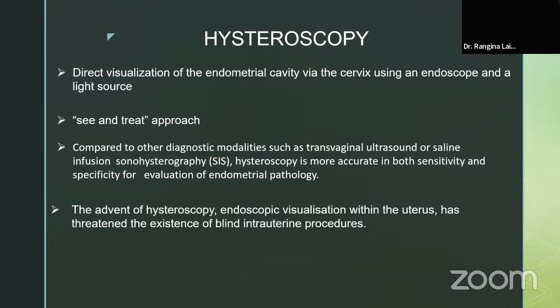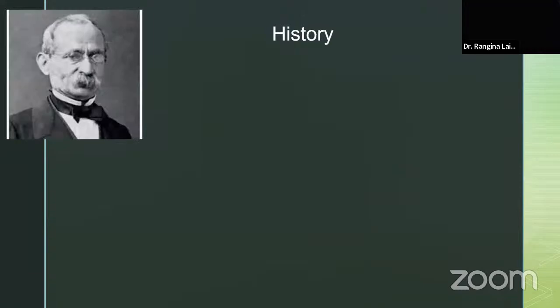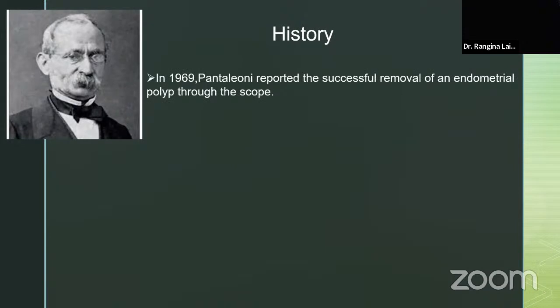hysteroscopic guided endometrial biopsy. And when we inserted the scope, we could see in the right lateral a small endometrial growth, and we took out that small tissue, and it came out to be an endometrial carcinoma. So how important it is for us to change our practice today from the world of blind DNC to the hysteroscopic world.